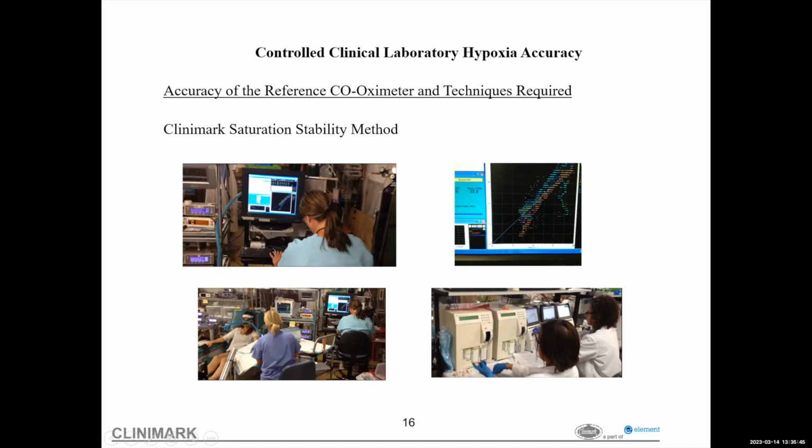The inspired gases are controlled by the computer, the operator here. This happens to be Dina Rayleigh, who started designing pulse oximetry sensors in 1982. So go figure, you can do the math. And then the information is displayed in real time, transfer standard regressed, so that we can see what's going on with the pulse oximeters as we're going along and see what kind of stability we have. But let me make it clear that we only assess stability based on the controlled pulse oximeter and not the device under test. So that's my story, and I'm sticking to it. I'll turn it over.